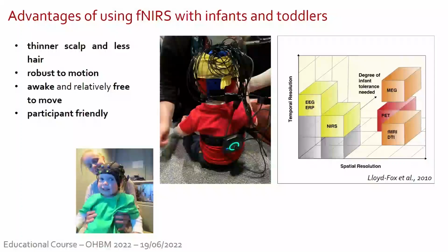And the fact that they're so comfortable staying with their carer all the time, to be fair, makes the outcome of the study go very well, because they're very comfortable and they're not stressed out about being separated from the mom. Or, as you see on the right, this is another wearable system that we just got in our lab, and it allowed the toddler to just walk around without really bothering about it. And as I said earlier already, we can measure both oxy and deoxy, which is good to get a good sense of whether we are getting a real HRF or a false positive.